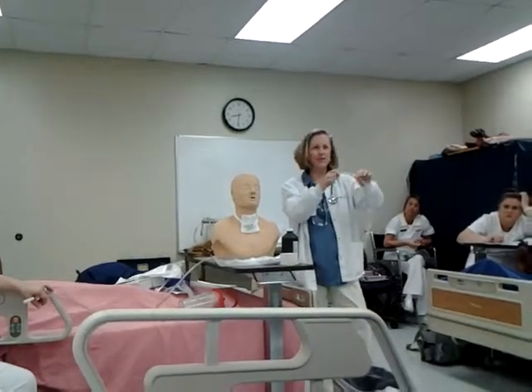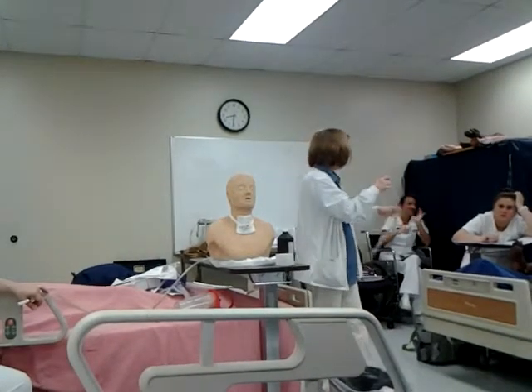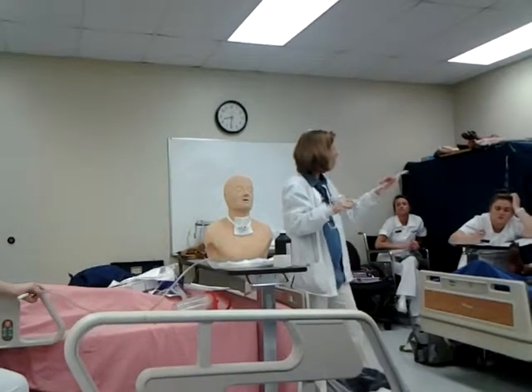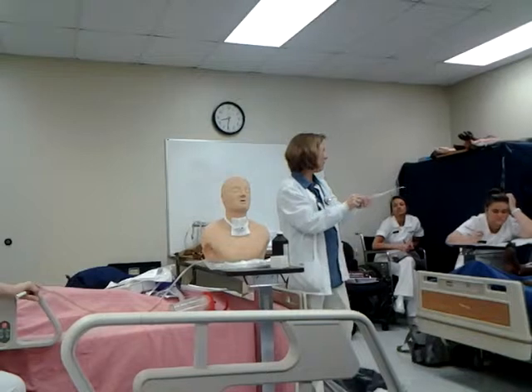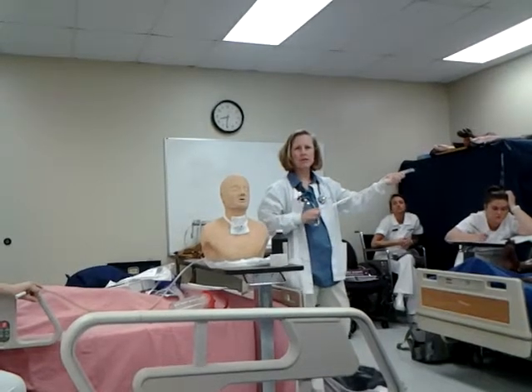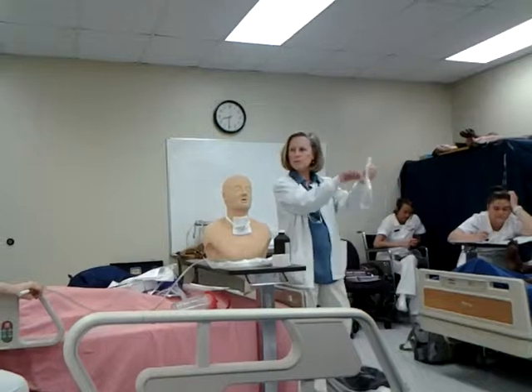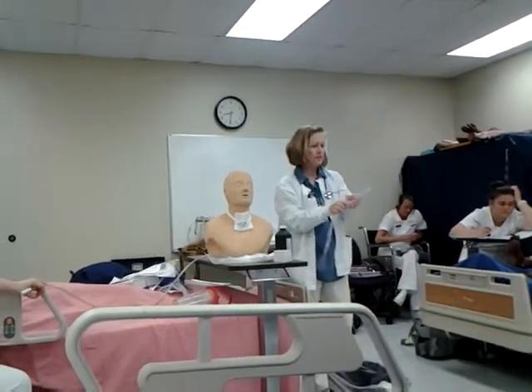You know, I can see a new student going, well, the Foley catheter, we took it out of the sleeve. We're going to rip this one off of the sleeve. But with ventilators, they're in a plastic sleeve, and you can use them for a certain length of time before disposing of it. So you have to look at hospital policy in terms of how long you can reuse that. This might be gunky, but his patient's gunky, right? And you can still clean it.